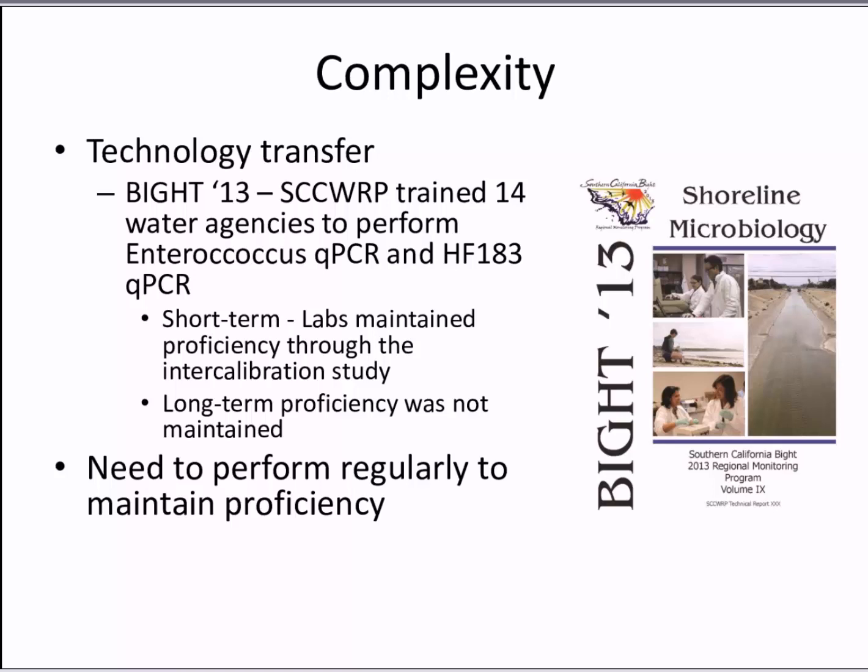So, if you're routinely running the assay, you can maintain your proficiency. But in this study, because most of the sample collection occurred in 2013, 2014, labs weren't running the actual PCR assays until 2015, 2016.